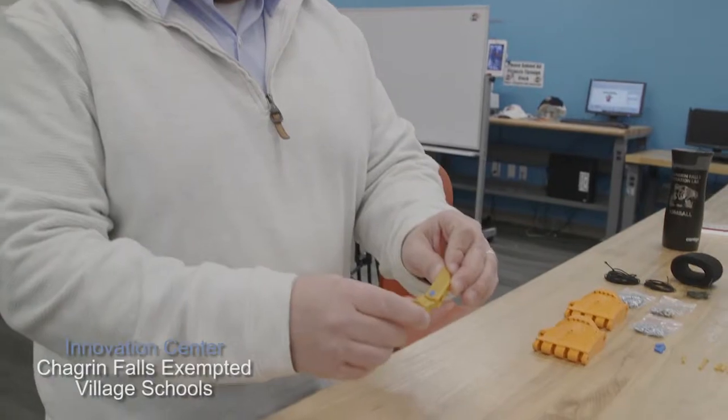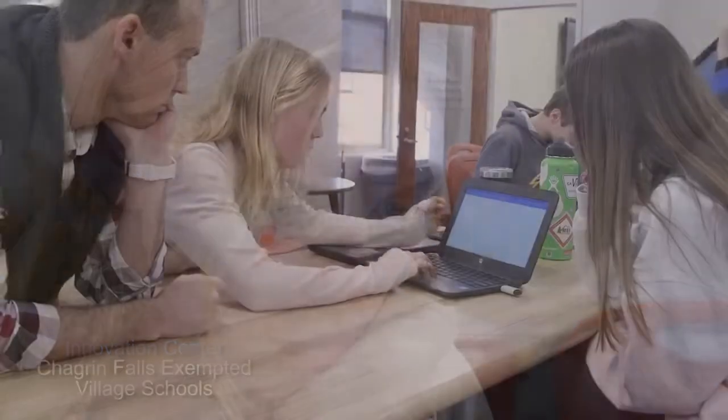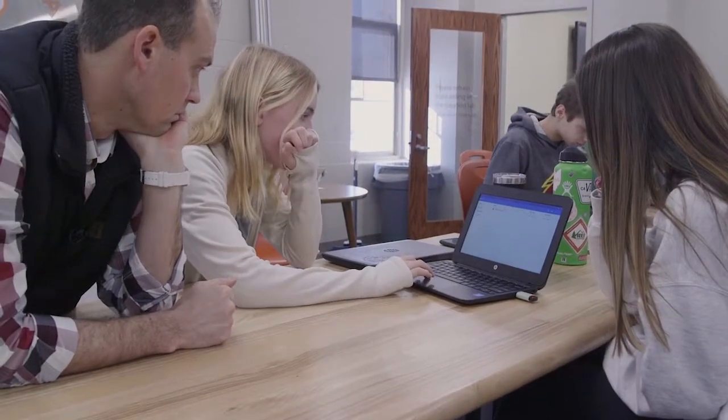You have your knuckle, fingertips, and then you have pins. Fingers take on new meaning for 8th graders in Chagrin Falls Exempted Village Schools Innovation Center.